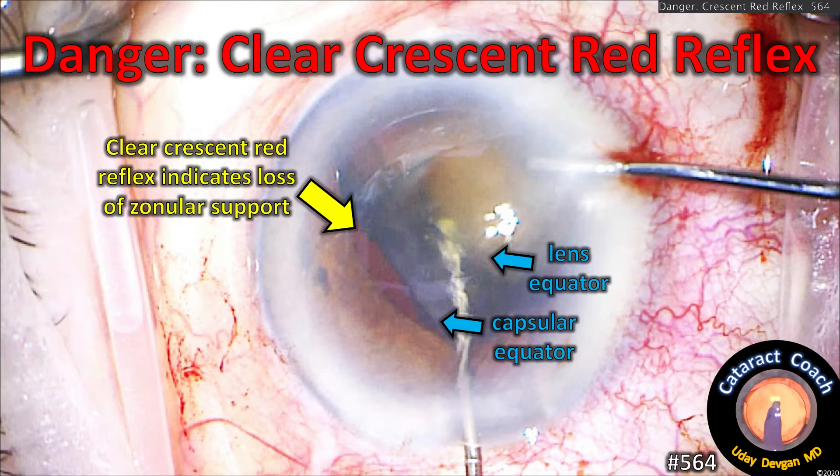cataractcoach.com. Danger. This clear crescent red reflex indicates there's total loss of zonular support. This is going to be a tough case.